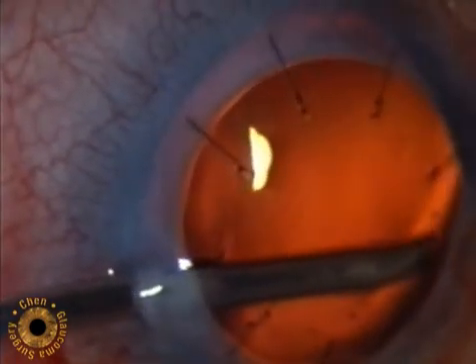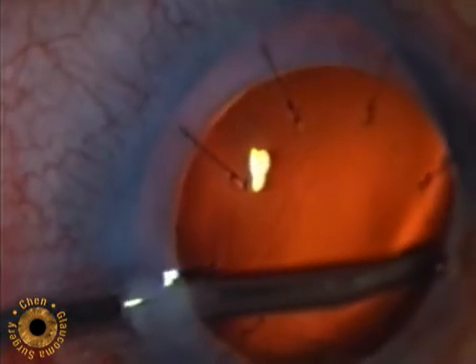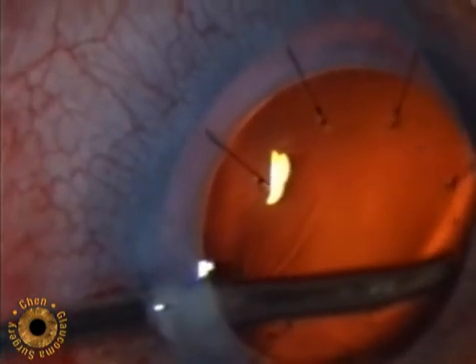Once the probe is properly positioned, the surgeon's attention is then focused on the ECP monitor to directly observe the treatment.